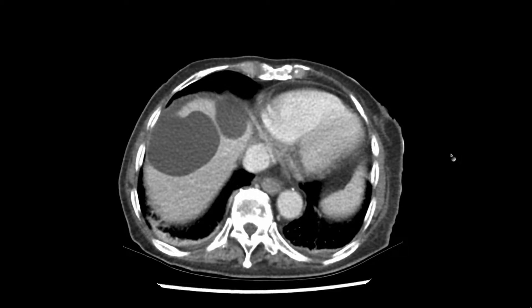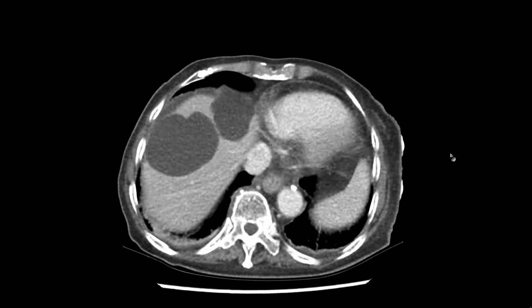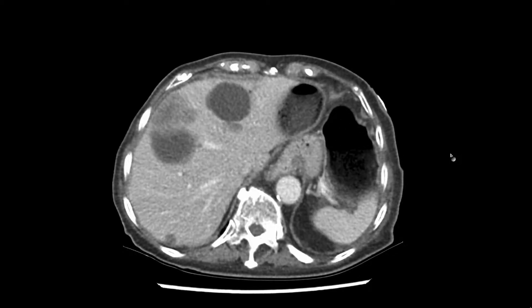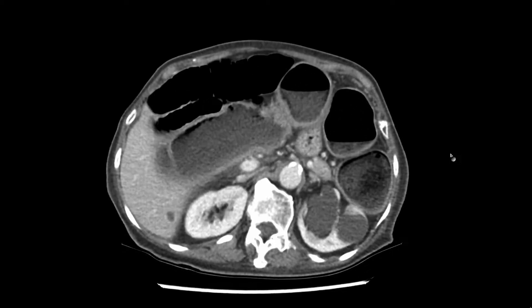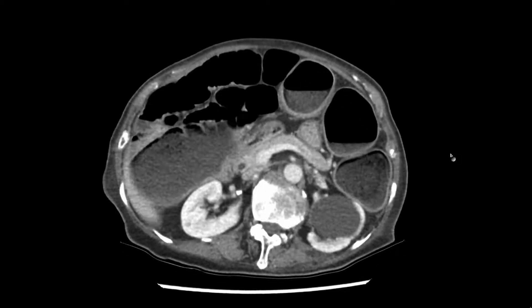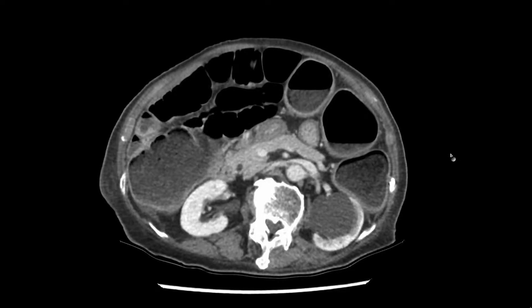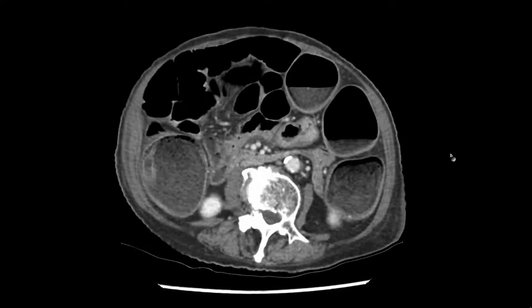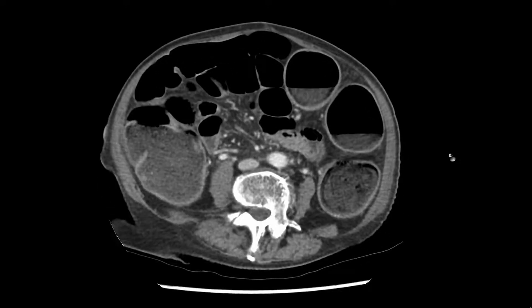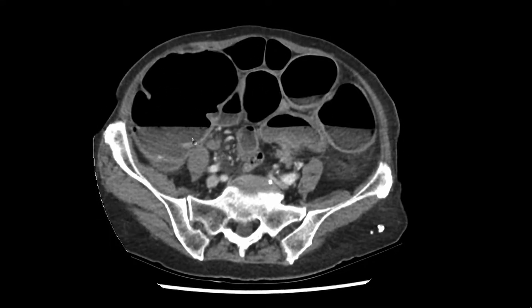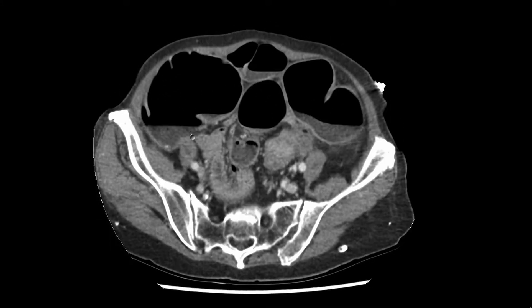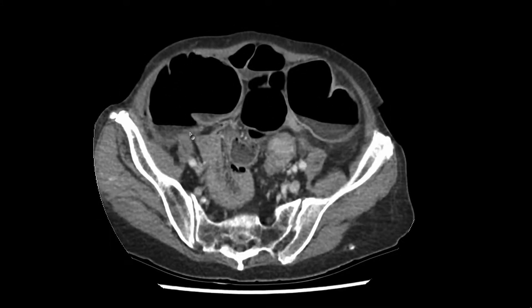This is a CT scan of the abdomen with IV contrast. Starting at the top, we scroll down. Immediately we see that there is abnormality of the large bowel, characterized by generalized distension containing multiple gas and fluid levels.